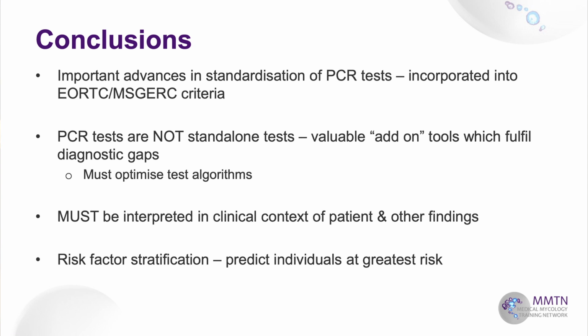So in conclusion, important advances in standardisation of PCR tests have occurred in the last 10 to 20 years, and we've seen these incorporated into the EORTC criteria. But PCR tests are not standalone tests. They're valuable add-on tools which fulfil the diagnostic gaps, but we must optimise the test algorithms.